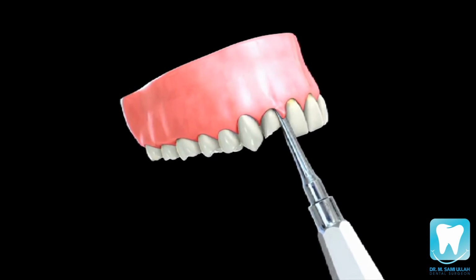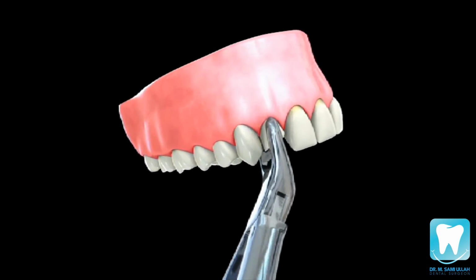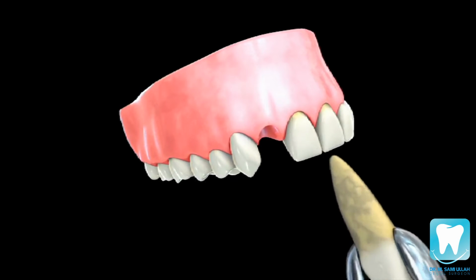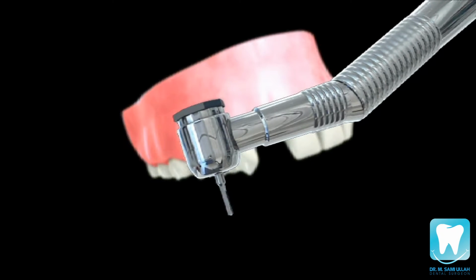A dental instrument called an elevator is used to wiggle the tooth in its socket. After the tooth is loosened, it is removed using forceps, or in some more complicated cases, a surgical handpiece is also used to assist with the removal of the tooth.